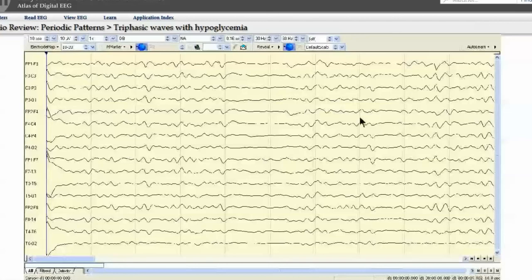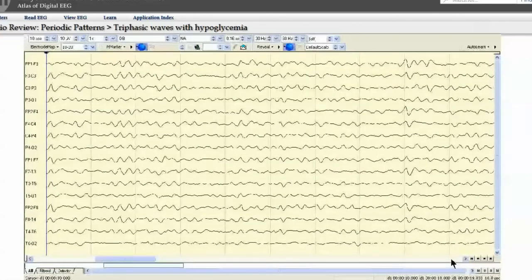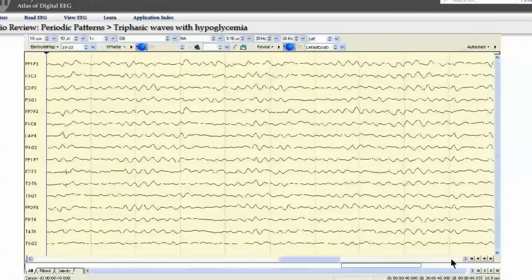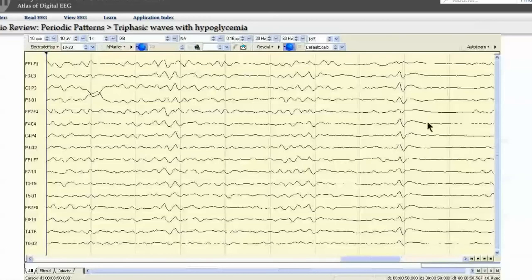In this EEG, however, there are some phase reversals, albeit without spike slow wave morphology to accompany them, and the dominant feature essentially is sinusoidal theta activity. There's some waxing and waning with periods of suppression between the theta activity, and as we go through the remainder of this segment, we can see largely sinusoidal theta of medium voltage predominating the picture. Here at the end is again a somewhat more triphasic morphology seen before a period of suppression.